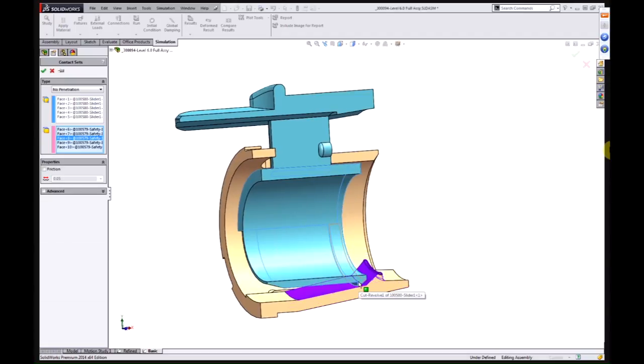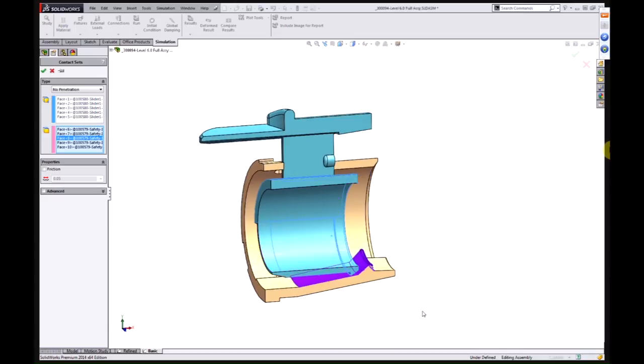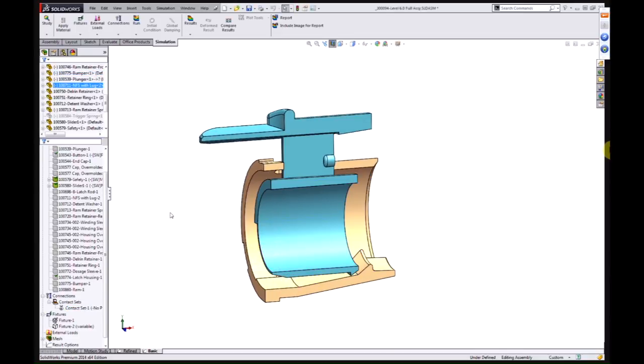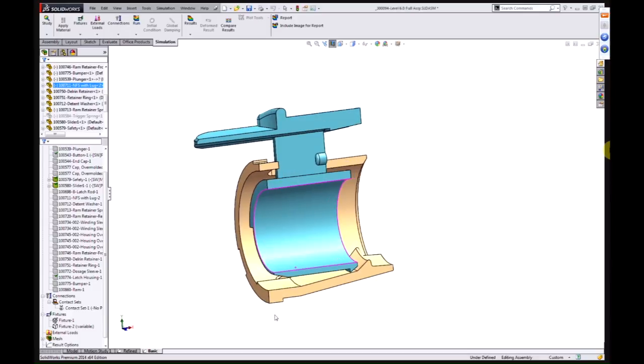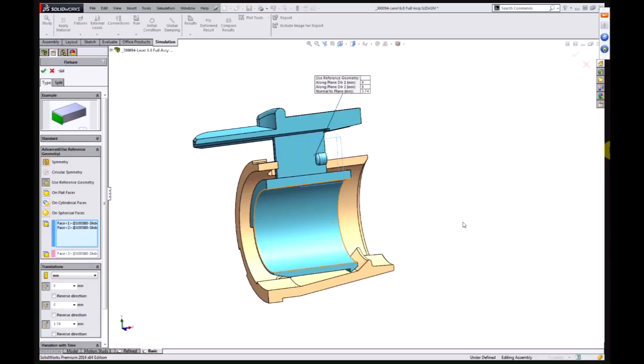In terms of how the parts move, I've got the cream part fixed at its root. That's where it connects to the next part in the system. And I've asked the blue part to basically move from left to right a distance of 4 millimeters. That should be enough for it to move past the guide there. So that's a pretty simple setup, and we can go off and solve the analysis.